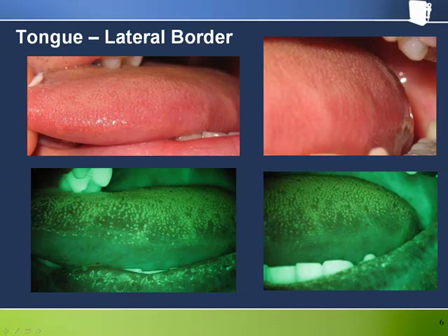Here are some pictures of the lateral border of the tongue. Notice the boundary between the dorsal surface populated by fungiform and filiform papilla and the lateral border. You'll notice some darker areas along the edge of the dorsal surface of the tongue corresponding to the scalloping marks from the teeth that are also evident under white light. The tongue lateral border proper looks quite bright and unremarkable.